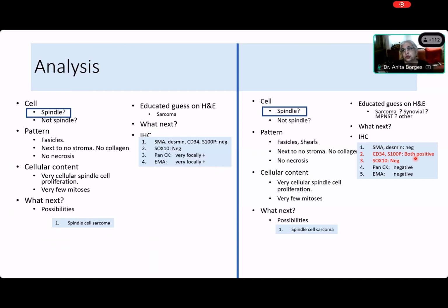Come on, Elsa. You know the answer. We have to answer the question of which sarcomas that are spindly and cellular might express cytokeratin and EMA. And this one's yes. There you are, synovial sarcoma. Yes, somebody saying epithelioid in the chat box. If it was epithelioid, they wouldn't be spindle. We are talking about spindle. Yes. So you are right, Elsa.